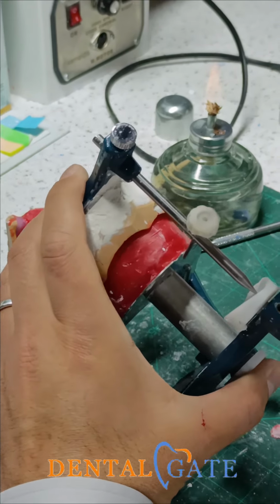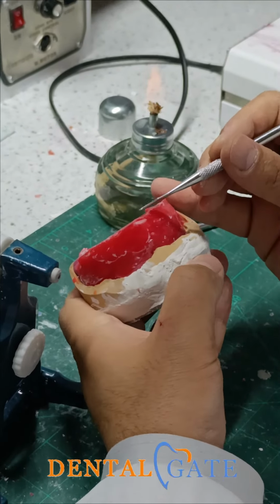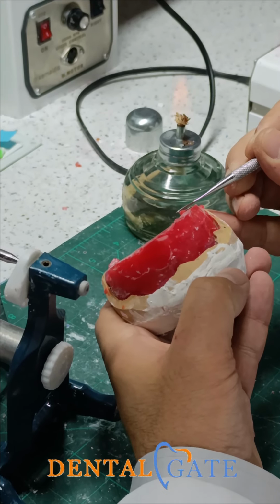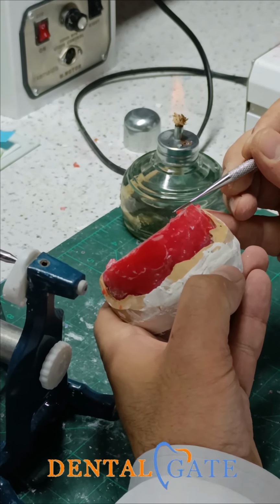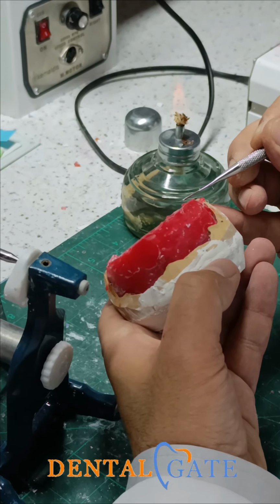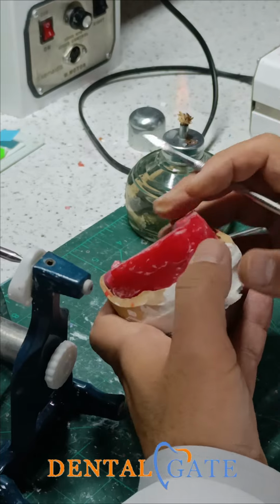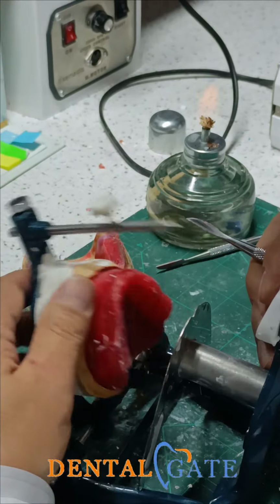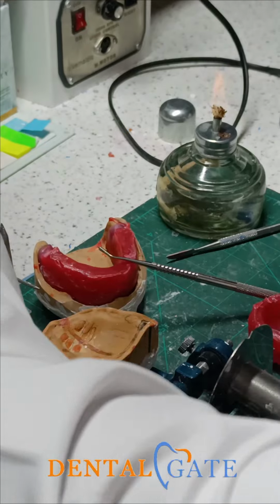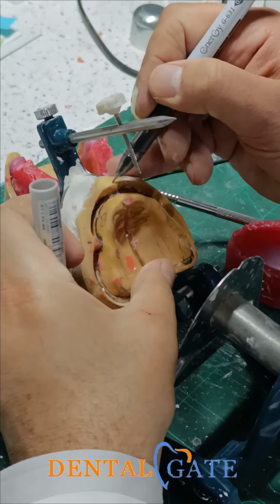Okay? What does that mean? The occlusal plane will pass from the tip of the lower central incisor until it reaches the last cusp of the molar, and will contact what? It reaches the retromolar pad. Okay? So regarding the midline, we will assign the laboratory one. We will depend upon the incisive papilla.